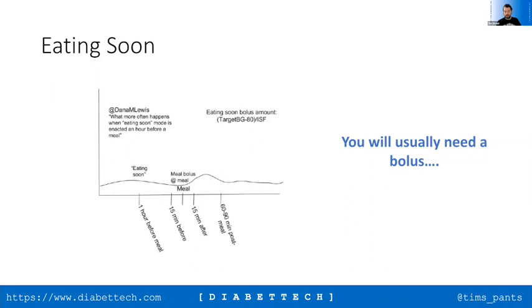So what it's then going to do, if you're using Loop without auto bolus, is increase your TBR to get you to that 4 target. That's not going to be a huge amount of insulin. So let's assume your ISF is 2 millimole per liter at that point. In order to get you to that 4 target, it's looking at that 4 target over the duration of insulin action. So it's expecting that if it gives you insulin now, you will get to 4 millimole per liter in 5 hours. So that's what it's giving you the insulin to do.